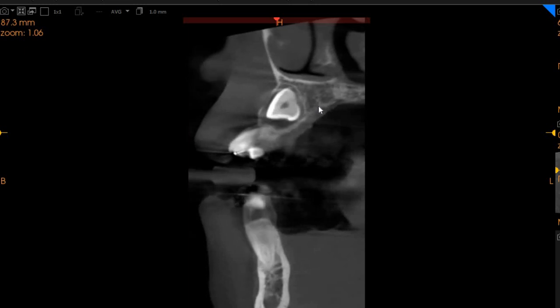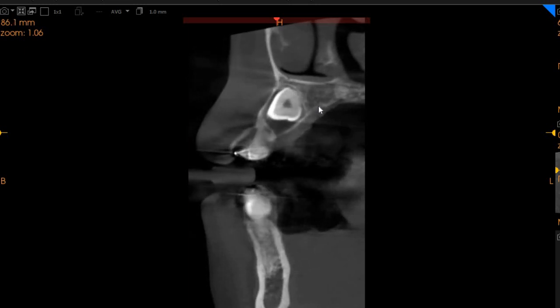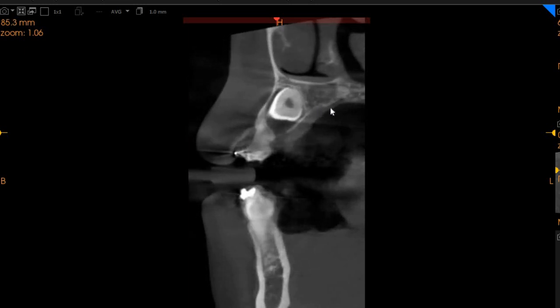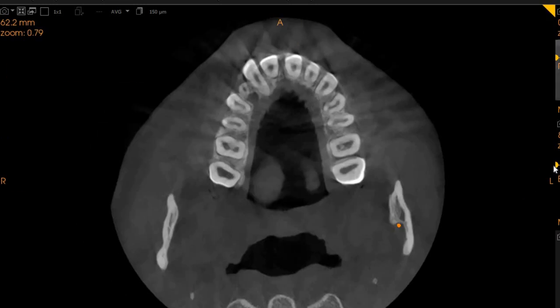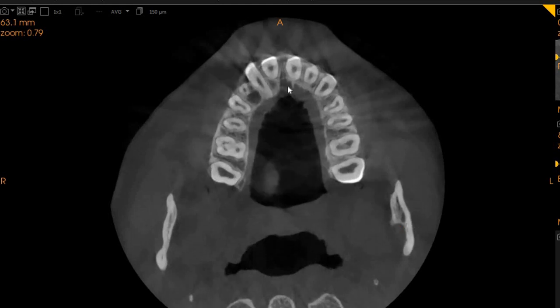So this is how it looks on the transaxial view. There does not seem to be any resorption of any of the permanent teeth because of this canine. Now moving to the axial view, which is the top-to-bottom view. This is the central incisor, and this is the lateral incisor, which is placed more horizontally.